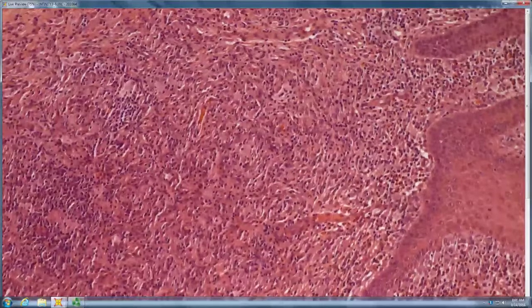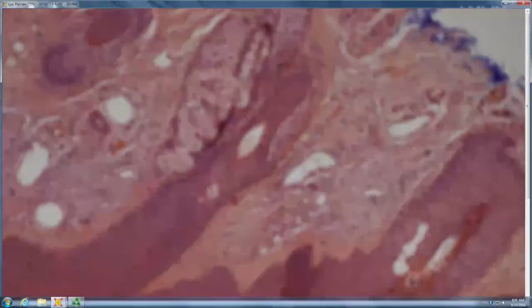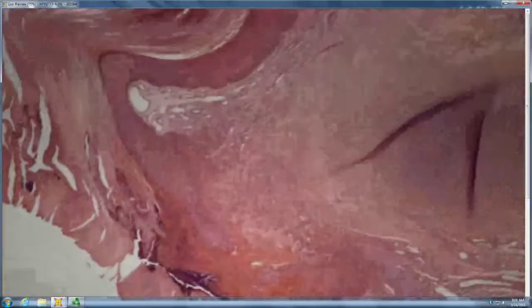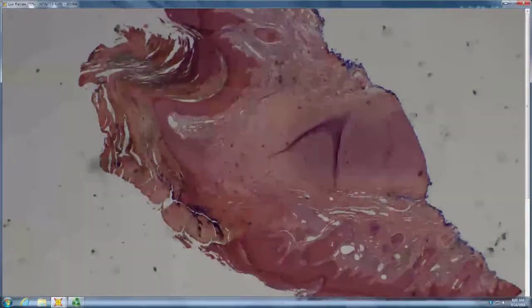Reticulohistiocytic granuloma can sometimes have lots of eosinophils, even juvenile xanthogranuloma can have lots of eosinophils, and rarely Rosai-Dorfman can. What would you favor on that one? I'd stain it. So I'd put a Langerin on that. S100, both Rosai-Dorfman, actually some JXGs, as well as LCH, can all be S100 positive. So CD1a or Langerin would probably be more informative.